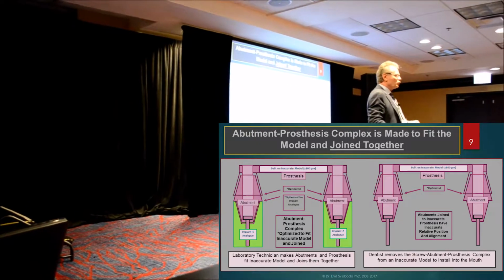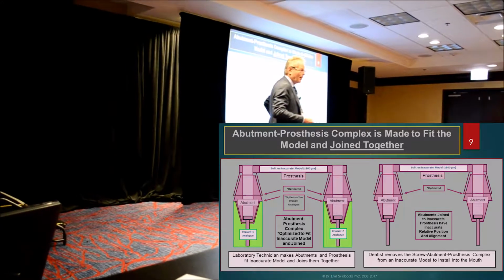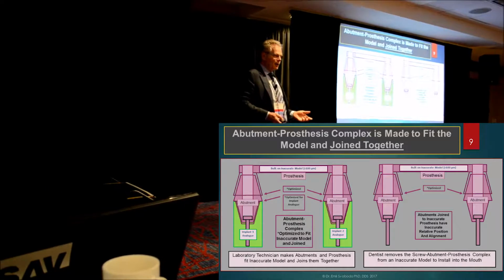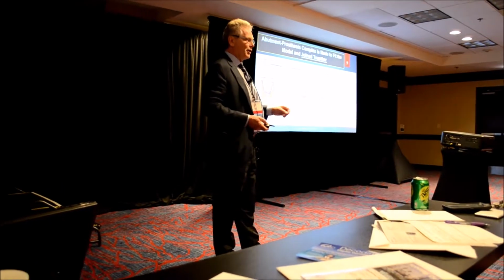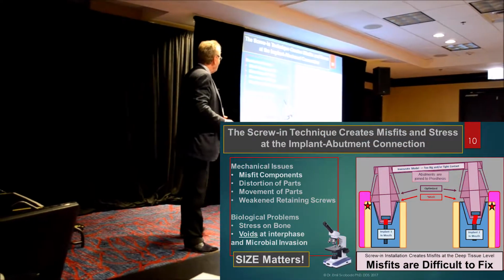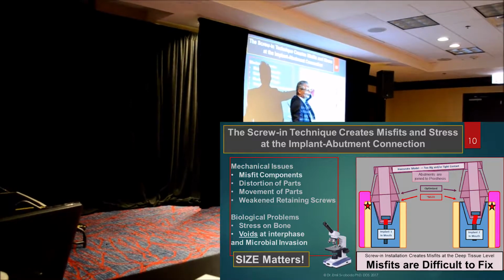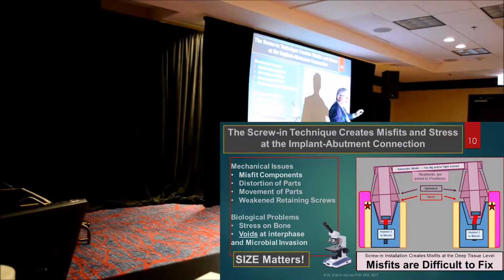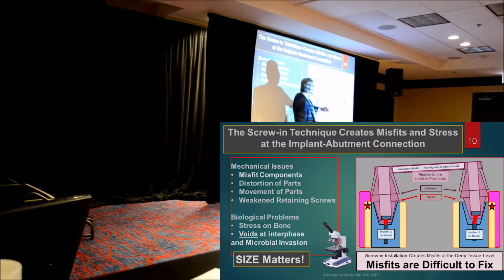And there are a lot of devices we'll talk about that fool us a little bit into thinking it fits, like the multi-unit abutment. But it's not really fitting because we can't make things that parallel. And we are tactile and we're visual. There's a whole world out there that's not within our resolution. And so here we go. When we try to put it in, a few things happen. Let's say it's a little bit too big. Let's say there's a tight contact even on this side. Contacts will keep you from seating down too. So you try to get it in.